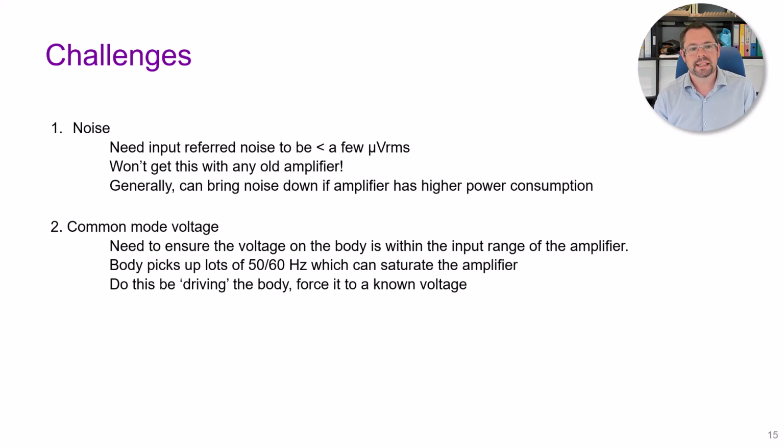The other big challenge is around what's called common mode voltage, and we'll see this as we move through, but typically we need a third electrode to set up a basic EEG recording. This is because your body picks up interference from the electrical environment that's around you right now, and we need to take some steps in order to handle that interference that is picked up.